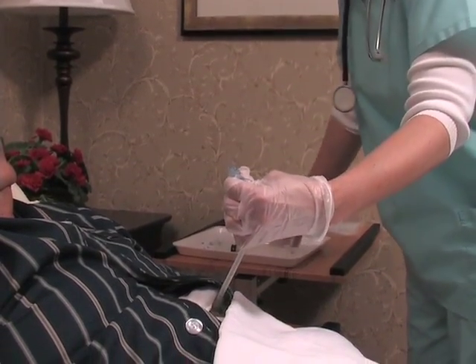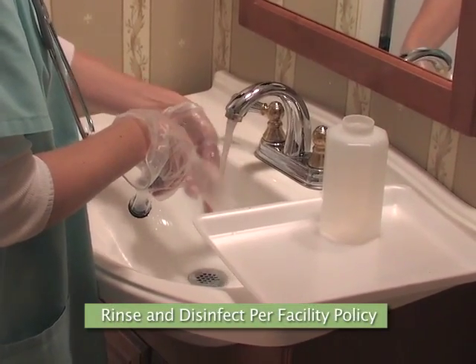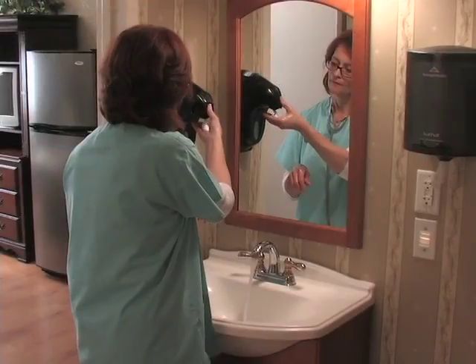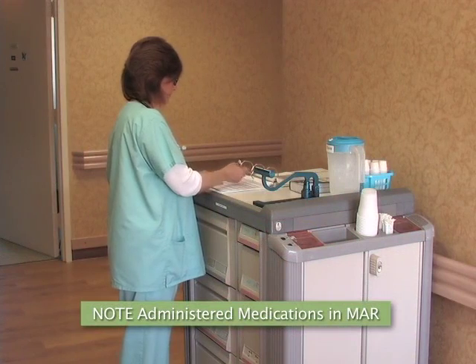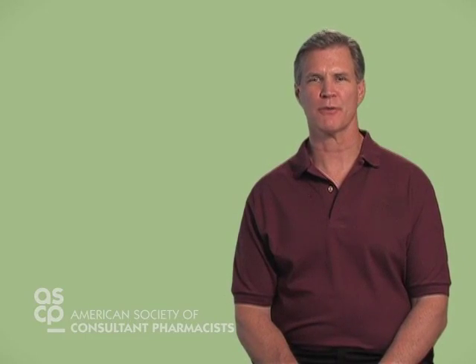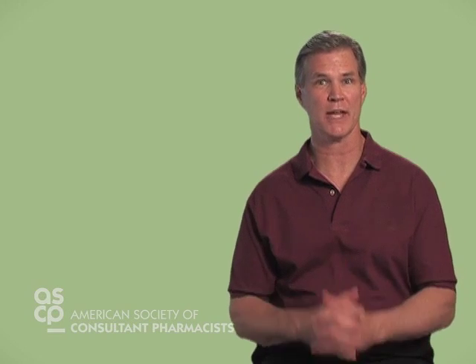After the final water flush, the nurse clamps the tube or, if ordered, attaches the feeding. The syringe and barrel are rinsed, and the parts are left separated to dry. All disposable cups, barrier, and gloves are discarded, and before exiting the room, the nurse washes her hands. The procedure is completed when all medications administered are noted in the medication administration record. We have just observed our nurse perform the procedure for administering medications by way of the G-tube. Now let's talk about a few potential G-tube complications you may experience.